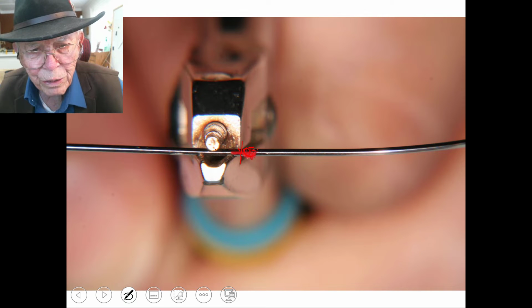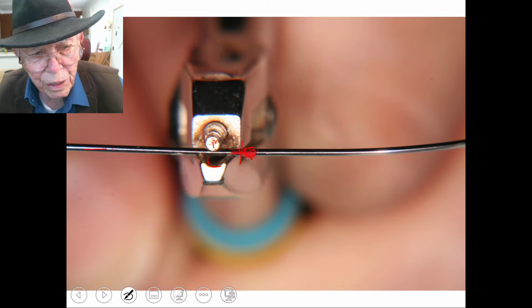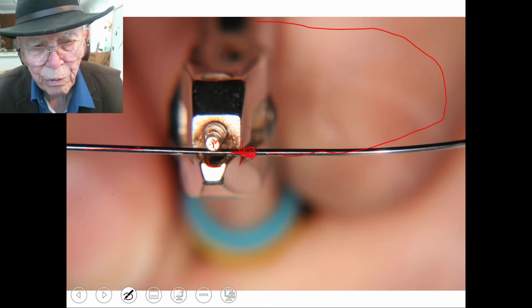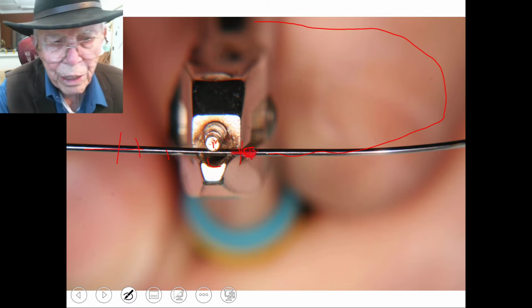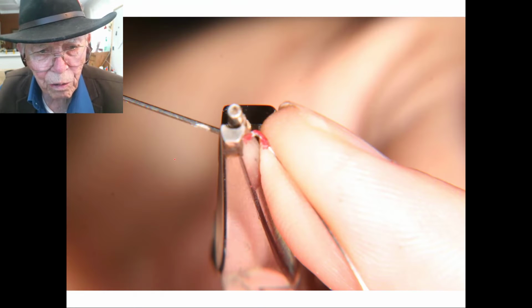And as we bend this, I'm going to mash this center part down, and this is on the second loop, and it's mashing it into a trough right here, and that will use up part of the wire from this end of it, not this anterior part. See, the archwire will go around like this and come back over here, and we're using the tail end of it here to do this.